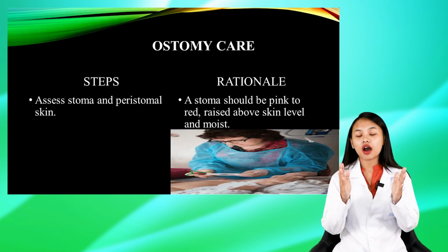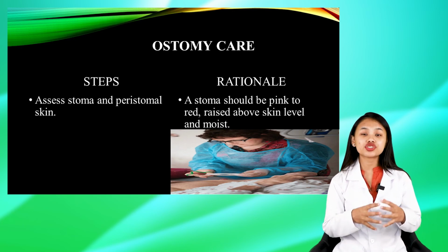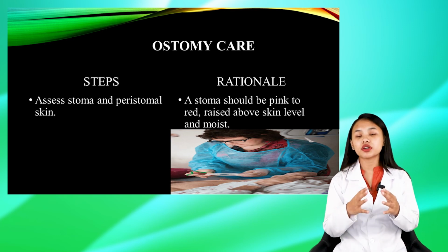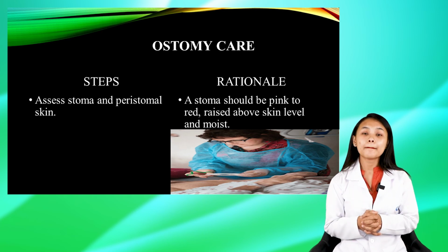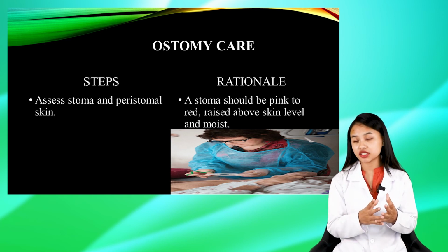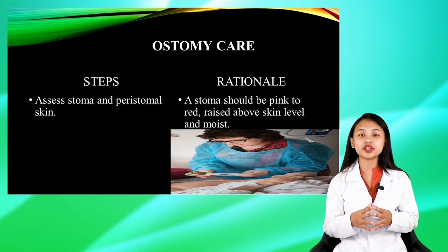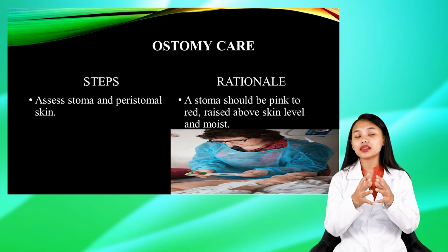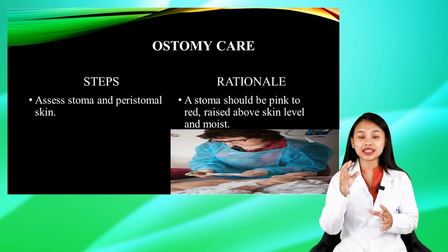So here, after cleaning, you must also assess the stoma and the peristomal skin. Because, as I have told you, a stoma must be moist, it must be pink or reddish in color, and it must be above the skin. And the skin that surrounds the stoma should be intact.